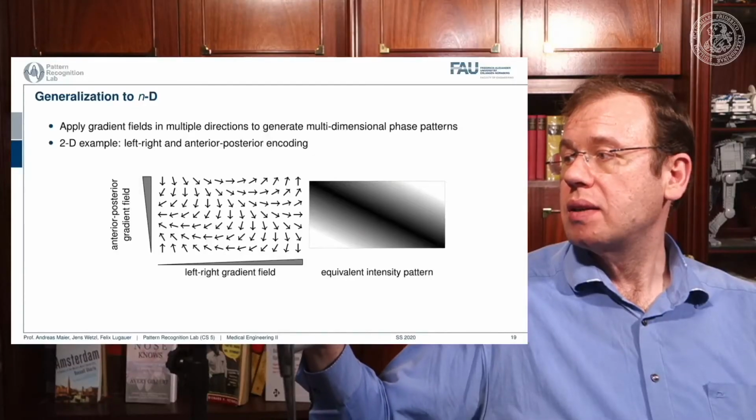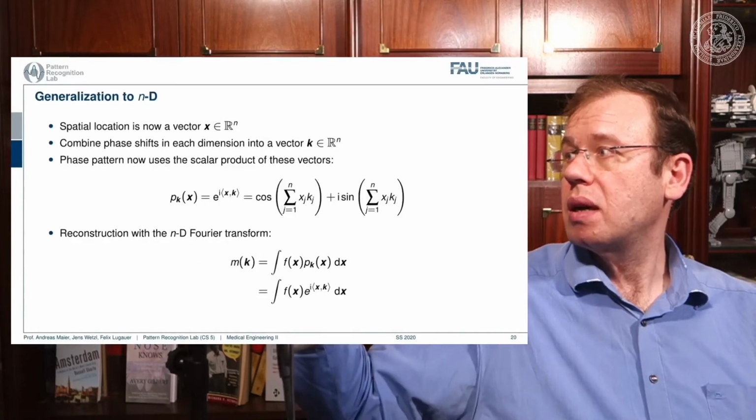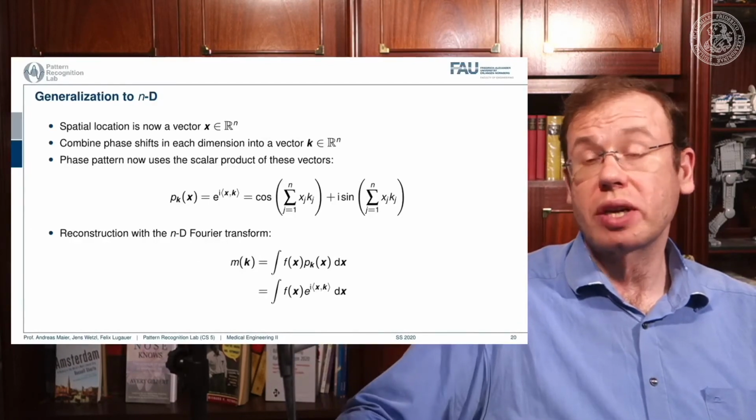Now if I do that, then I end up measuring n-dimensional Fourier transforms.